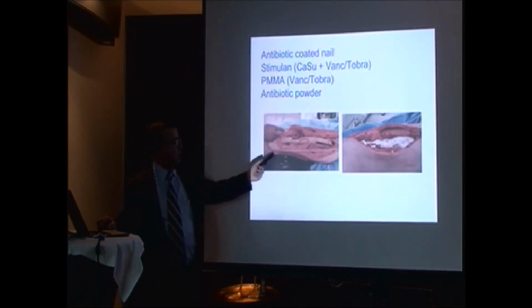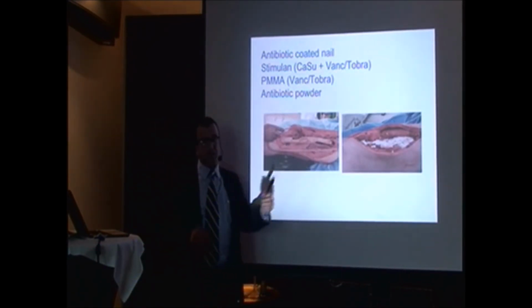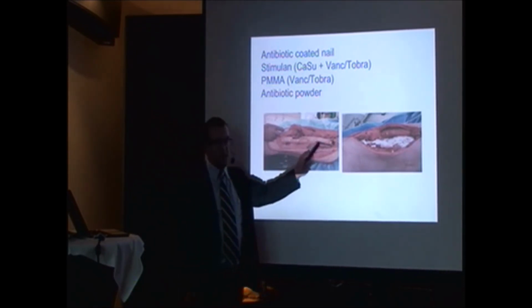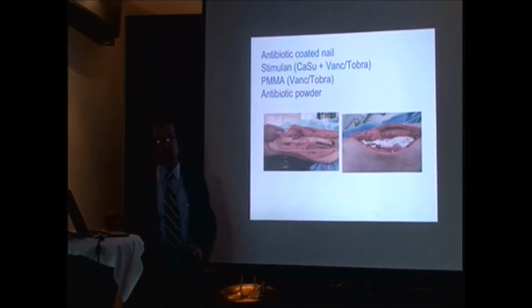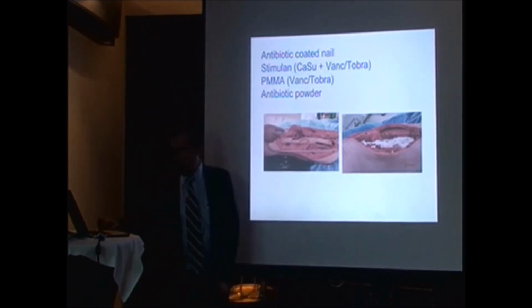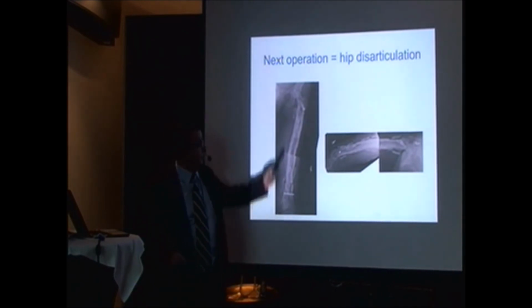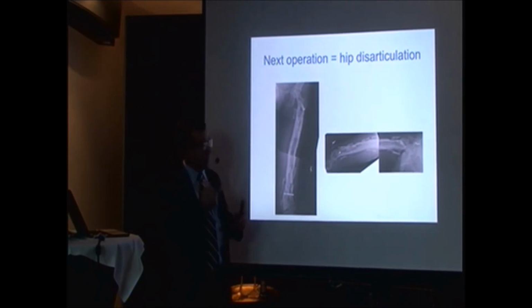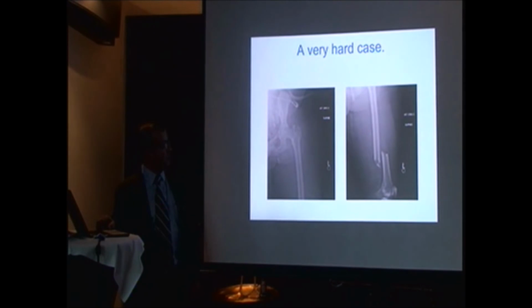saucerization, but by the time we open the femur, it's destabilized. So obviously we take out the middle, you leave only the shell. The shell has a lot of mechanically destabilizing areas. So now we have to neutralize and protect the femur. So what we do is we put a rod, antibiotics, powder antibiotic beads. We have the rod that goes inside surrounded with antibiotic cement, and we put beads in as well, but at least now we can monitor his healing.